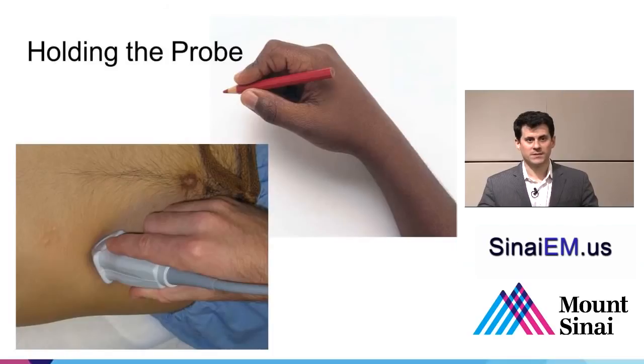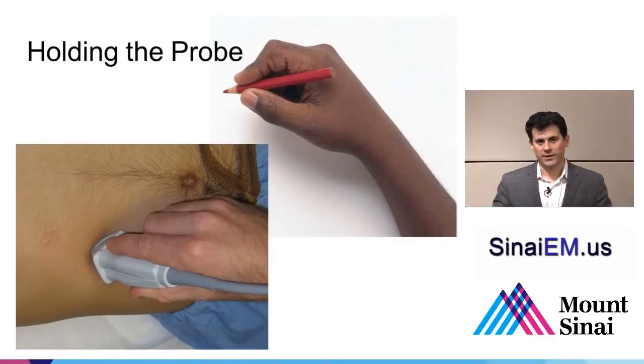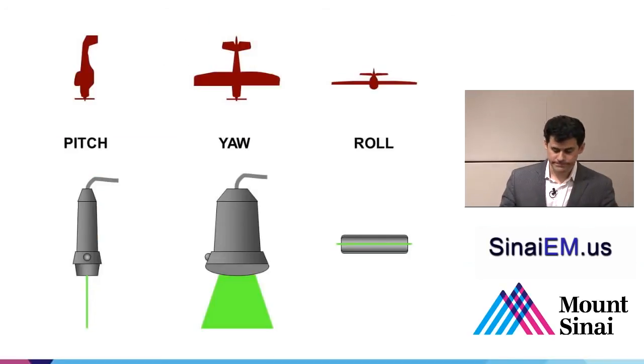And when you're using ultrasound to guide procedures, meaning that you're going to have a needle in someone's body in your other hand, it doesn't just become a convenience. It's actually fairly critical then to not allow yourself to slip. So using your pinky or using the heel of your hand and resting the probe like you're writing on the patient with the ultrasound probe is going to make a huge difference.